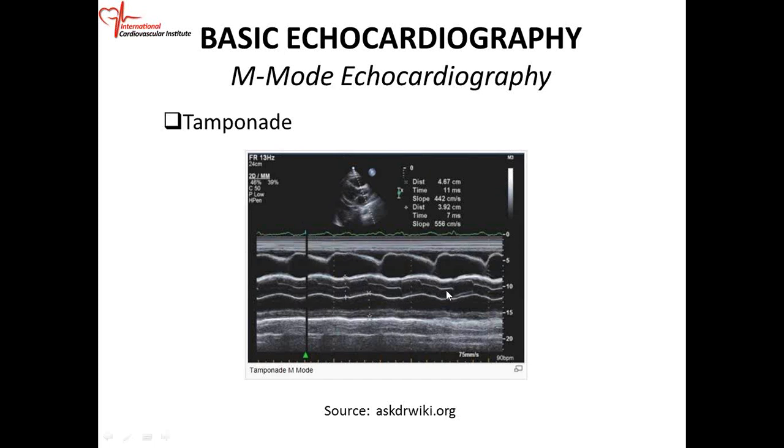It cannot do otherwise. So if you look closely, you can see that these collapses are diastolic collapse.